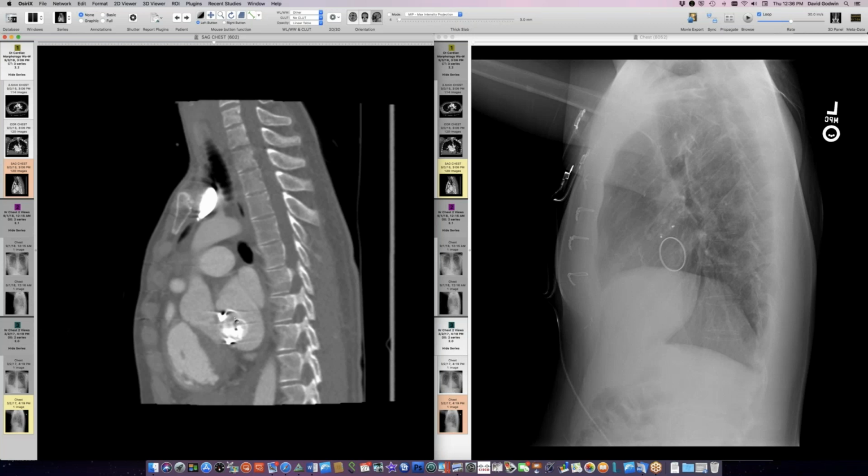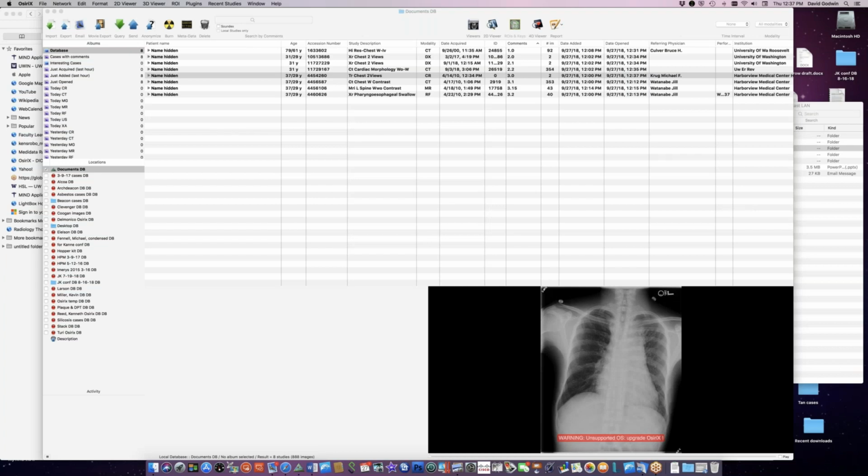That's crazy. I think it just goes to show understanding, how I always try to teach residents, understanding, not just say there's surgery from prior median sternotomy, but actually recognizing what's there. And that's the only hope of seeing this, is if you notice that something isn't where it used to be. Right. The resident who was on call that night did not pick it up, and I definitely would not have picked this up, but one of our attendings, who's a cardiac guy, did pick it up, and the CT was, of course, definitive. So I hope he picked it up before the CT, but quite a case.